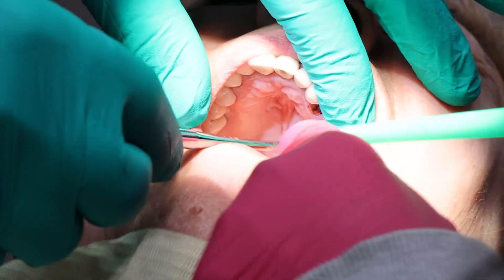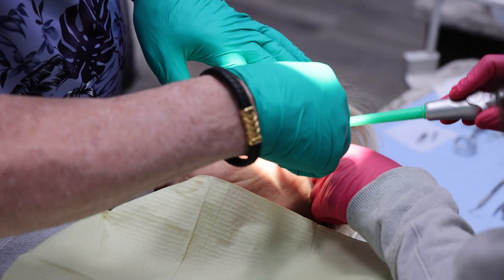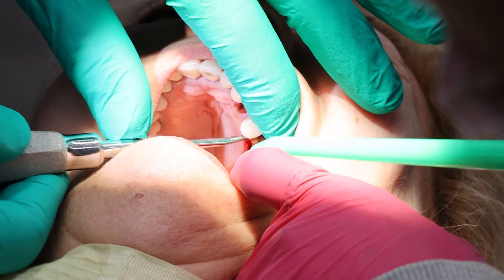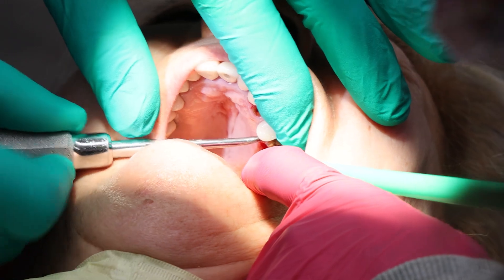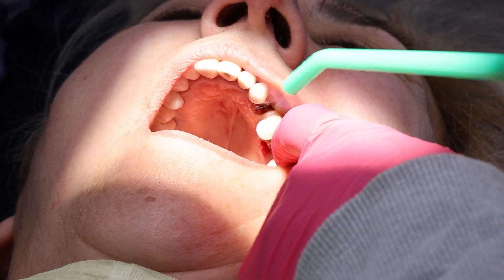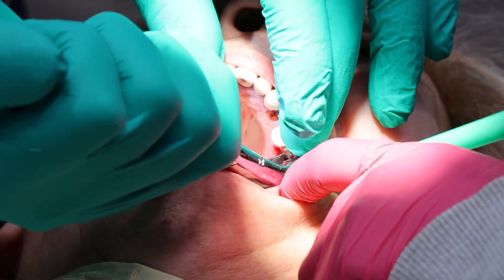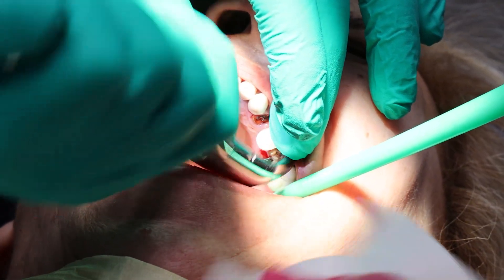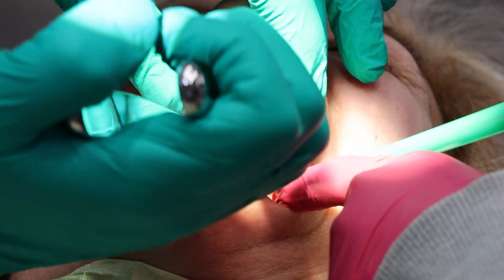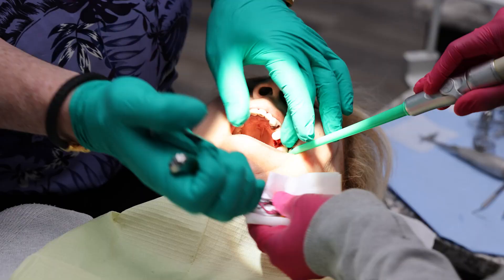We're just doing the upper on Michaela today. We're just removing the roots. Those roots are out.